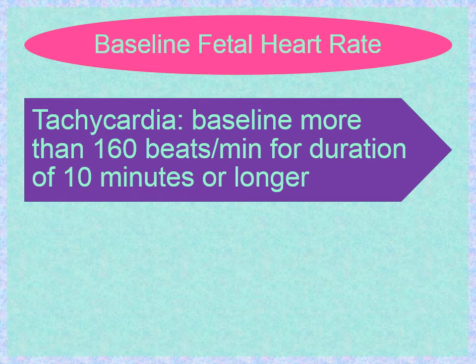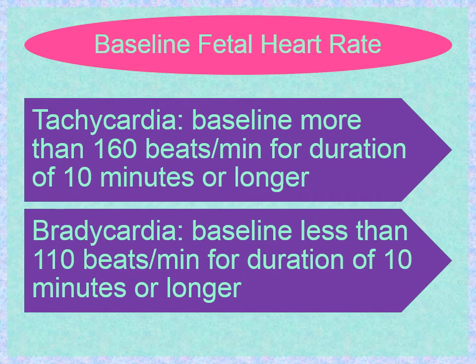Variations in the baseline fetal heart rate also include tachycardia, which is a baseline more than 160 beats per minute for a duration of 10 minutes or longer, and bradycardia, which is a baseline less than 110 beats per minute for a duration of 10 minutes or longer.